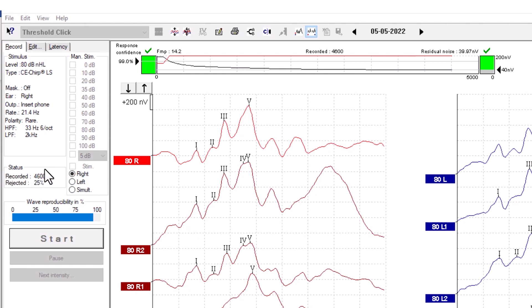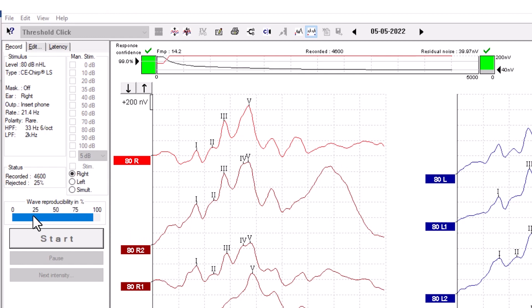The status window shows the number of accepted and rejected sweeps and percentage. Wave reproducibility is a calculation between an A and B buffer.